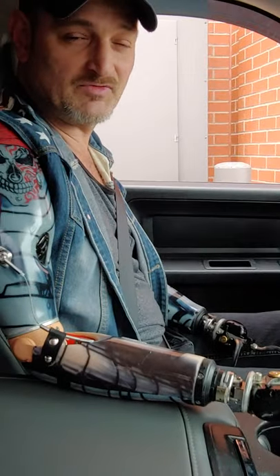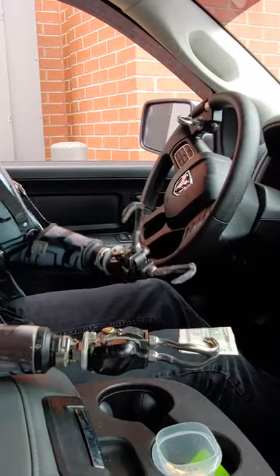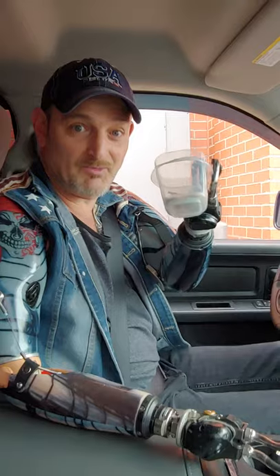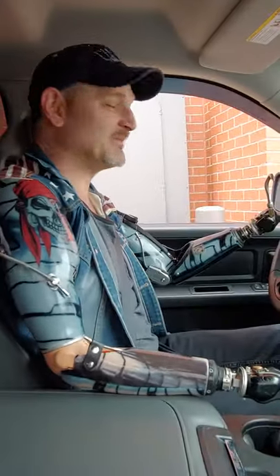Hey everybody, it's Billy P, the bilateral amputee. I hope everybody's well. About to go through a drive-thru here and I figured I'd show you how I do this with these prosthetics. I'm gonna use some cash — it involves cash and a piece of Tupperware. We'll be up here in a minute.